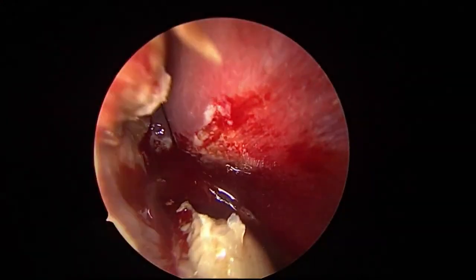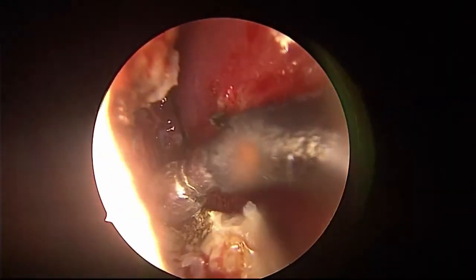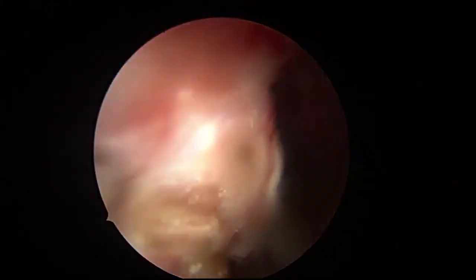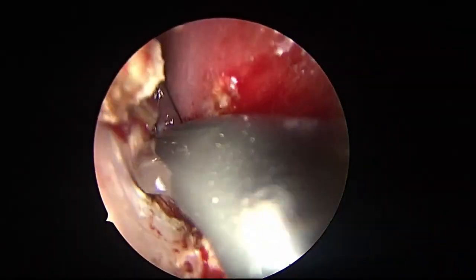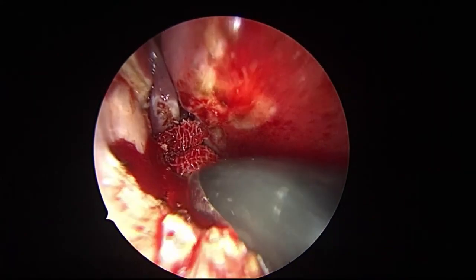On this bone, what will I use? The suction cautery, insulated suction cautery. See this? Or you can use a diamond, both can work.